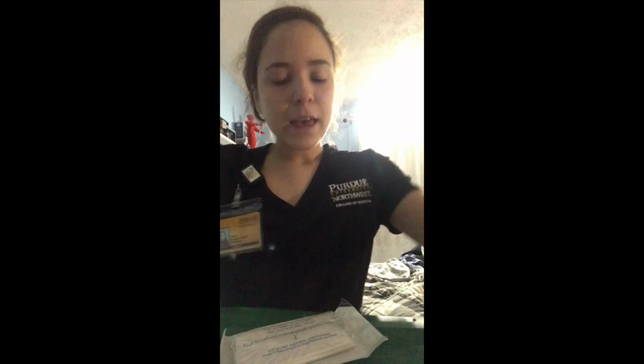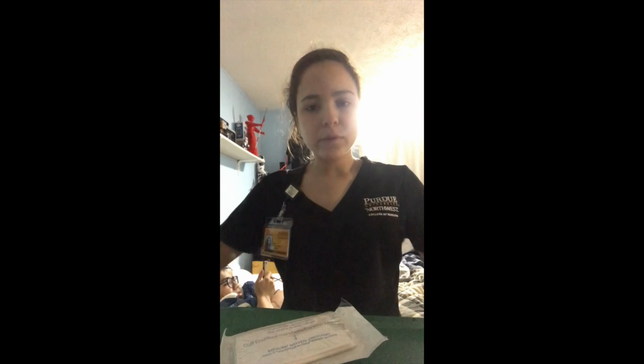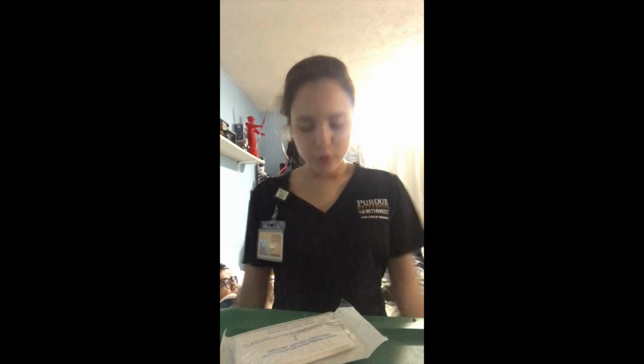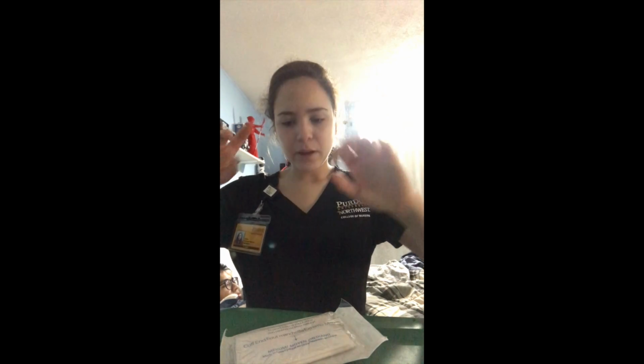And now I'm going to do my sterile gloves. It's the same thing. I need to have a working table higher than my elbow, and I should not put my hands down. Also, with the sterile field, you cannot be with your back to your sterile field, because if you do this, you're contaminating it. And also, don't put your hands below your table, just leave them higher all the time.